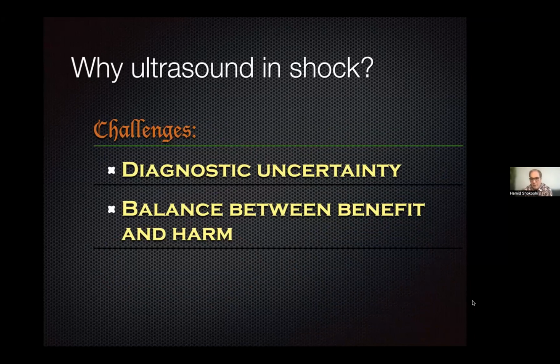Basically, why am I using this? Yes for mortality, yes for morbidity. But if I say that without ultrasound this patient is dying, that probably exaggerates the role of ultrasound. Using that outcome may not necessarily say the same thing for a lot of other technology that we use at the bedside. So it's not necessarily about ultrasound. It's hard to pinpoint whether a particular ultrasound I did clearly ended up saving this patient or not.